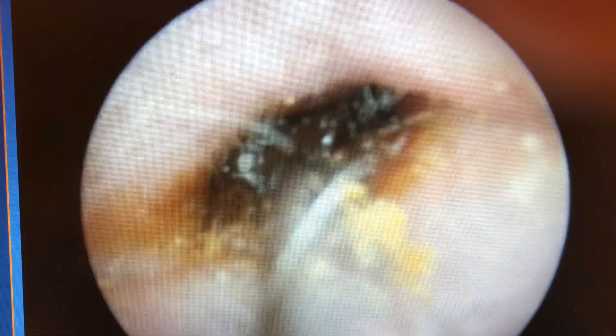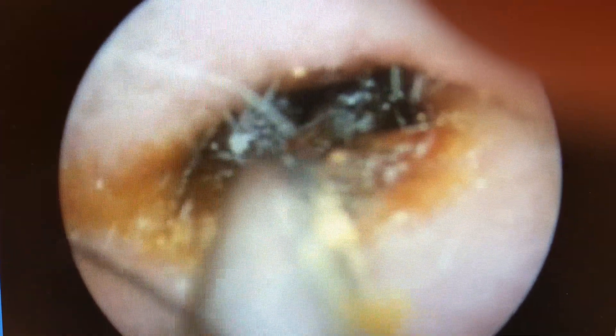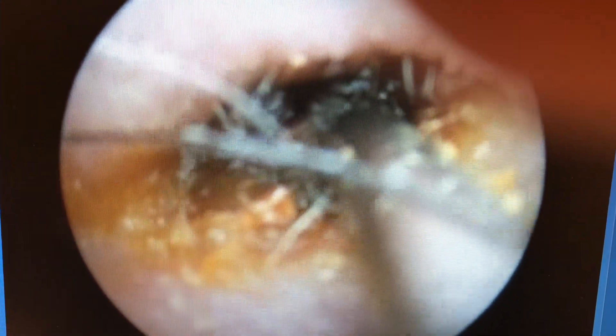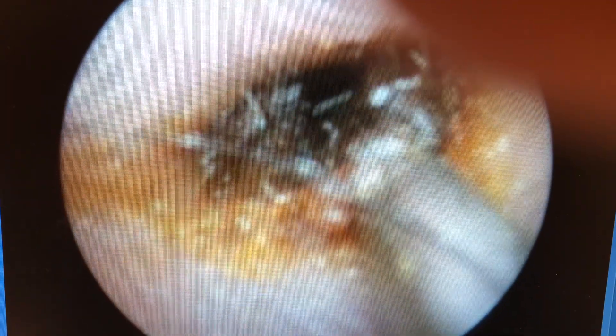This is a video demonstrating the removal of wax from the left ear of a gentleman. Wax is noted to be severely impacted, completely blocking visualization of the eardrum.